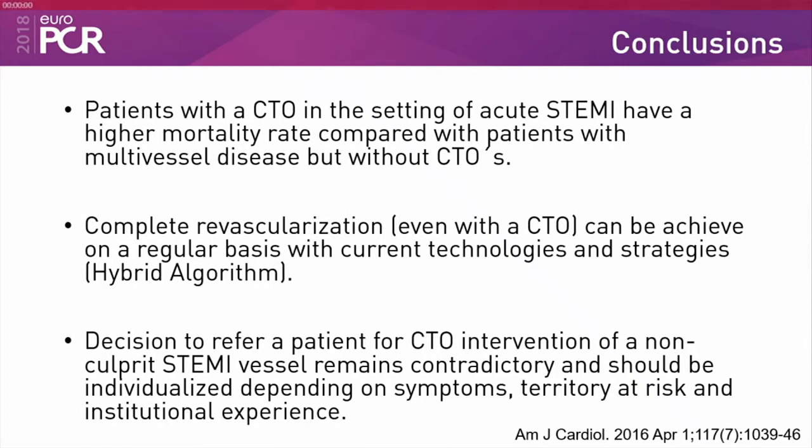Secondly, this is clearly not a patient to discuss this anatomy in this situation, to discuss if he is going to get better or not. I certainly wouldn't do a CTO in the same setting. No, because the artery is already open, everything is giving enough blood, and the collaterals are good. I agree that the CTO doesn't improve life.